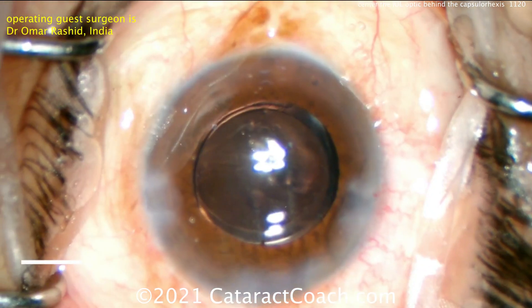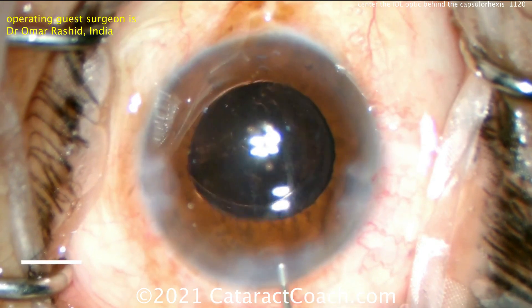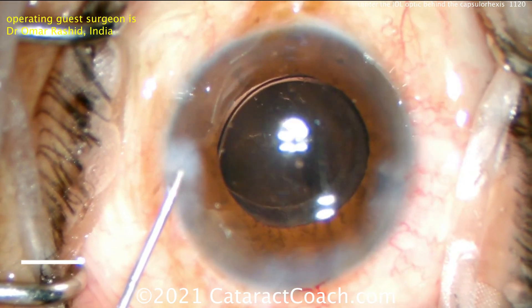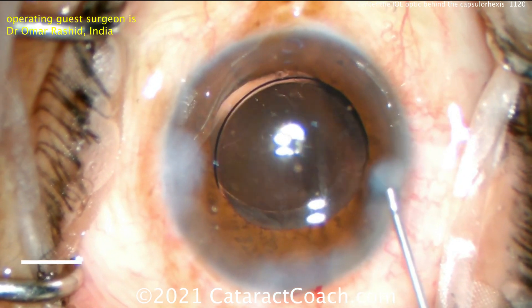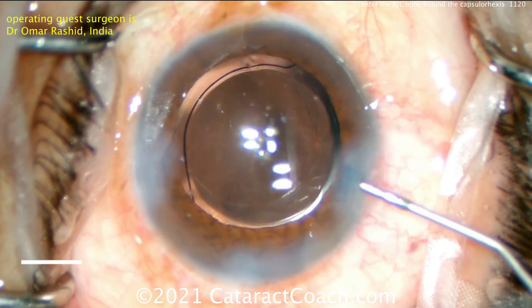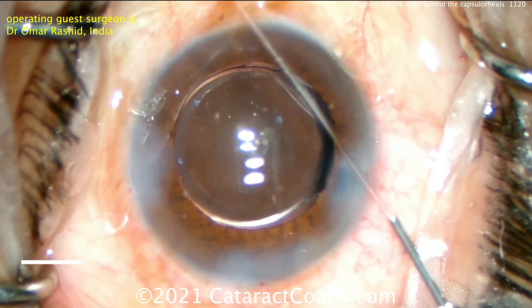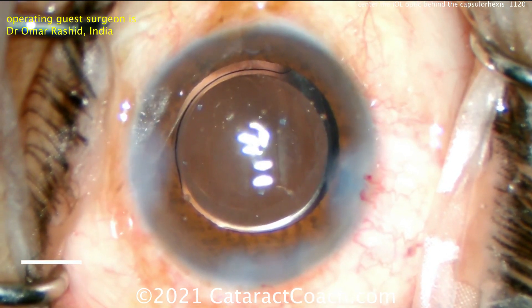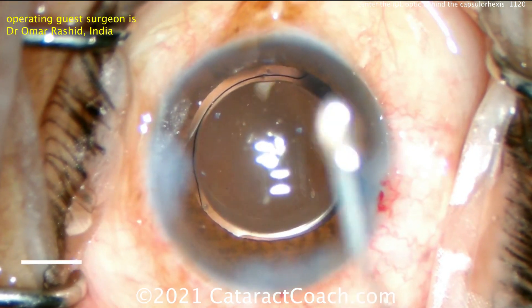Your signature is primarily your capsulorhexis and the incision, because those are seen forever by any ophthalmologist who ever looks at this eye, even a decade later. Also important is lens centration. You can see now that the distal optic edge is coming up out of the bag — you don't want that, you want the rhexis to overlap it. The overlap is asymmetric right now, so let's get that lens moved over — go inside the eye and push that optic behind the rhexis so the rhexis overlaps the optic 360 degrees. Now sealing up the incisions. The optic position looks pretty good but could be a little better — it seems like one end is still tilting up out of the bag. Beautiful surgery, Dr. Rashid — show me another one with a beautiful rhexis.